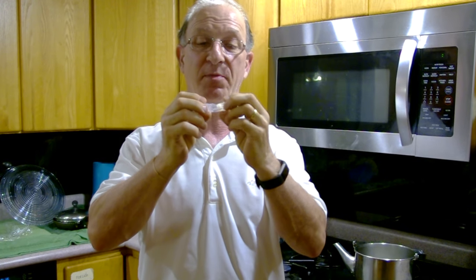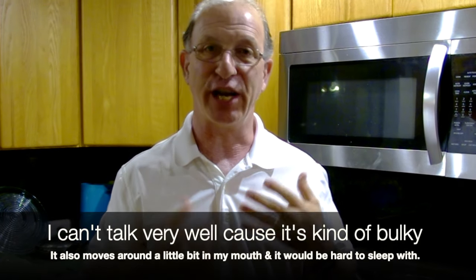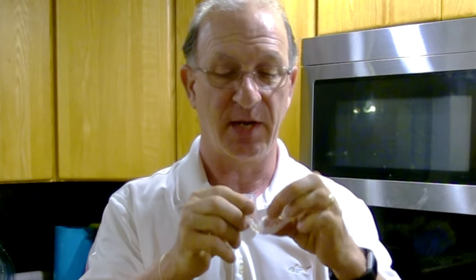Now we're going to trim it down, because if you put it in your mouth and try to talk you sound like this — it's kind of bulky. It also moves around a little bit in your mouth, which would make it hard to sleep with. I'm going to show you how I trim the front and back down to minimize the amount of contact in my mouth and make it a lot easier to sleep with.